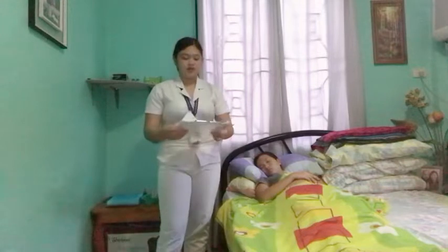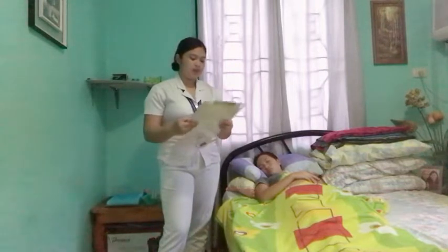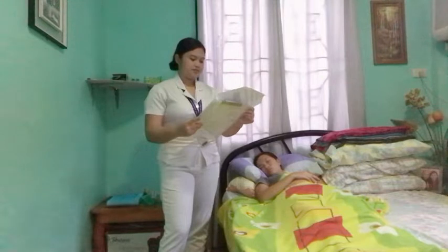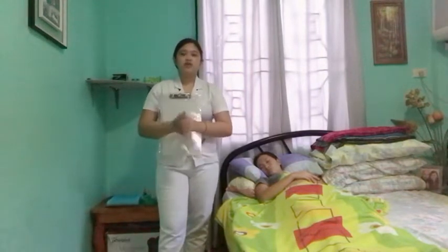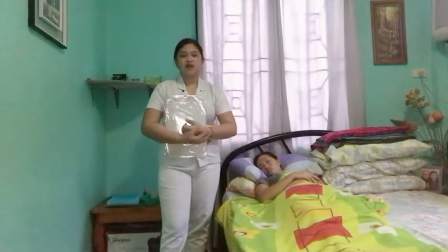So the first step we need to do is to check for the doctor's order for catheterization. This is to ensure that we have the right patient and the right procedure to be done. Okay, so next, washing my hands before preparing the set for catheterization is very important to reduce the risk of microorganisms that can cause diseases and contamination.